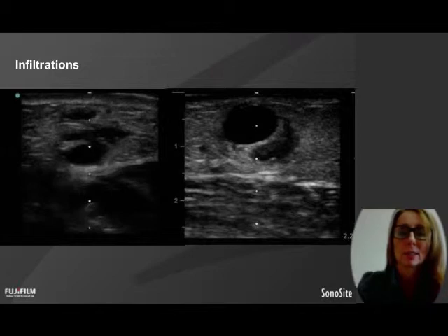And the one on the right, you can see that they've probably punctured, and as they've threaded, they've accidentally just pierced the side wall on the right just a little bit, and it's bled out and around. So this certainly would have been painful for the patient and resulted in some bruising, and if it was much bigger, it could have even compressed the fistula.